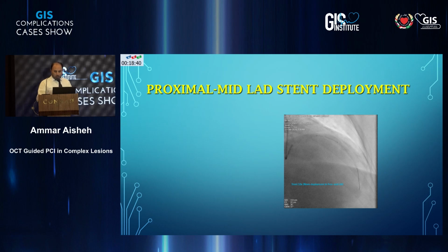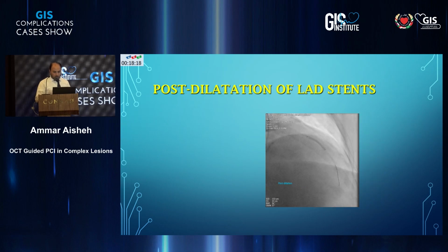Yes. The second stent was deployed overlapping the first stent from mid to proximal LAD, and we deployed a 3.0 by 28 drug-eluting stent, overlapping the first stent. We actually did some post-dilatation with the stent balloon itself, not with an NC balloon. This is the post-dilatation with the stent balloon. After that, we repeated OCT.